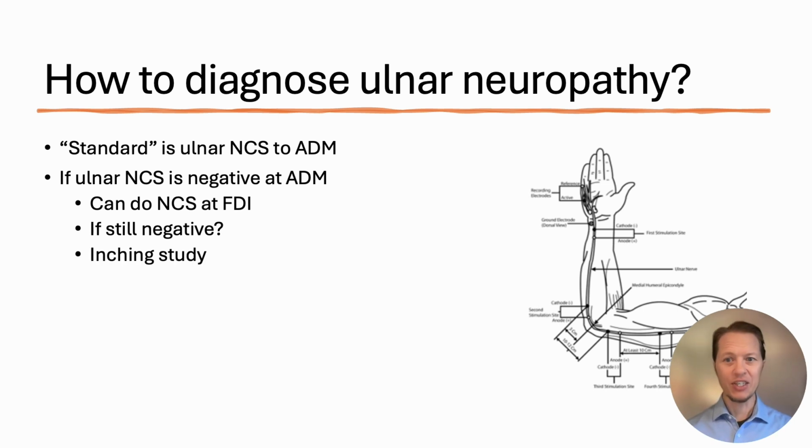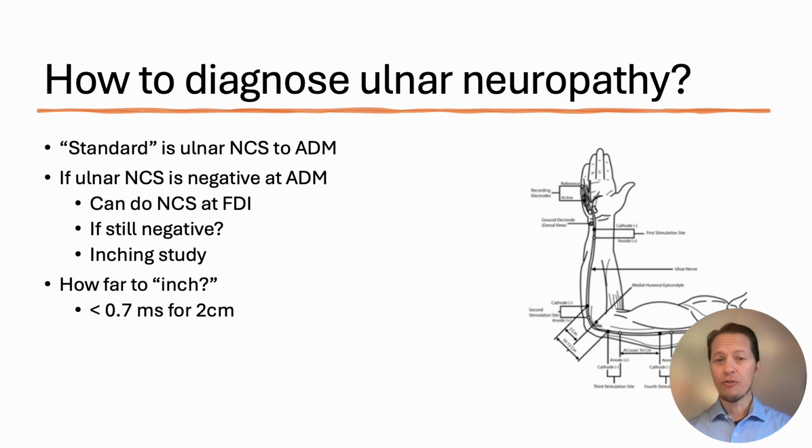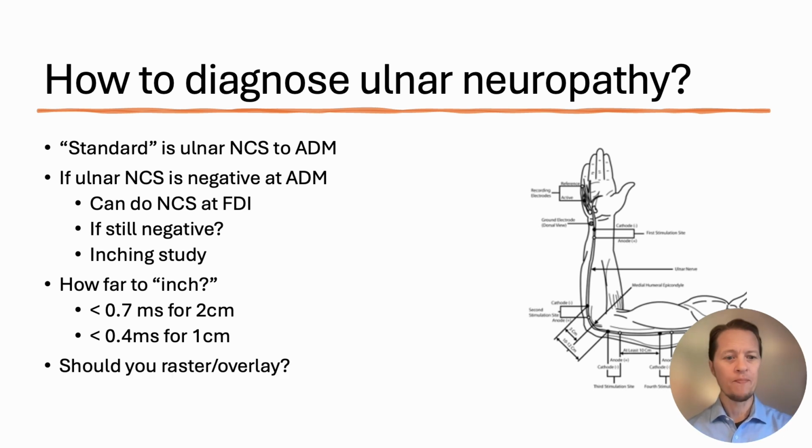Well, yeah, inching, that is exactly the best time to bring in your inching studies. That can take a while because you got to mark it every centimeter or every 2 centimeters. You really got to be spot on with your stimulation. And it can be a longer slog through your conduction study. How far to go? Again, 2 centimeters, I would say, is a little more commonly used than 1 centimeter. I ended up doing 1 centimeter. Did I not do the right thing? Would you have done 2 centimeters? Please let me know. I would love to learn from you.